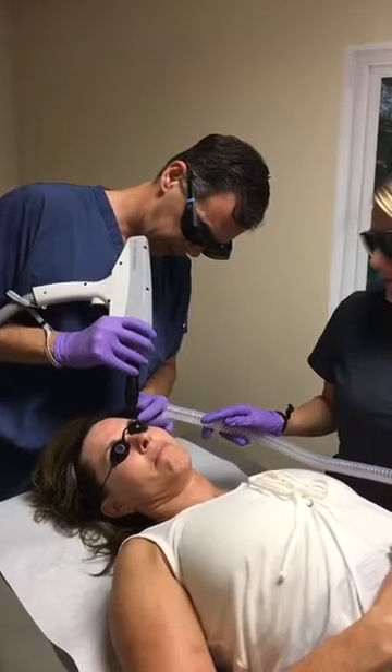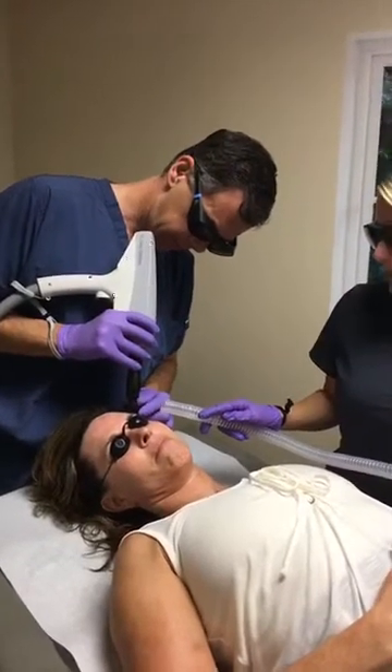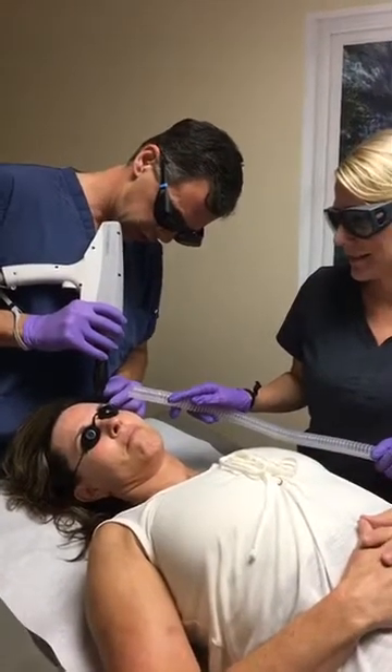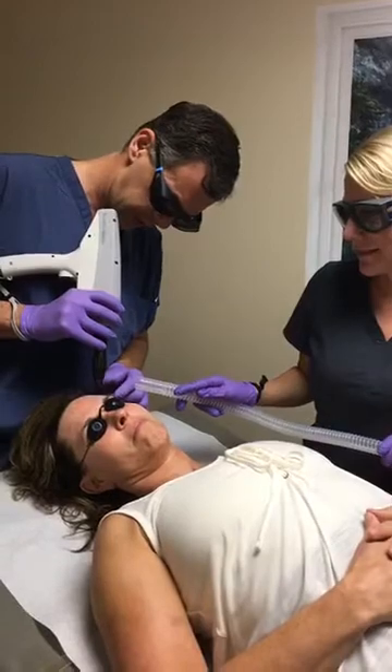As we finish this, she will be ready in a couple of days. Basic maintenance afterwards — you will have to just keep the skin nice and hydrated.